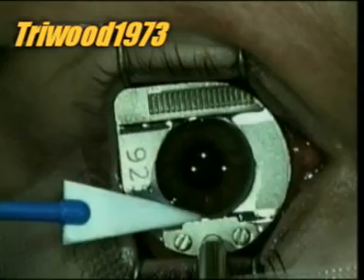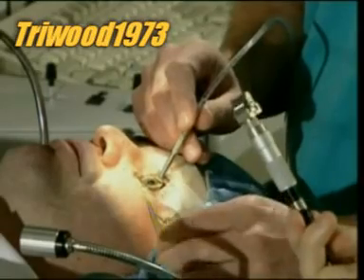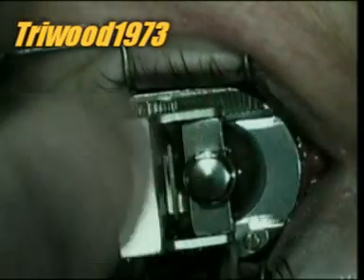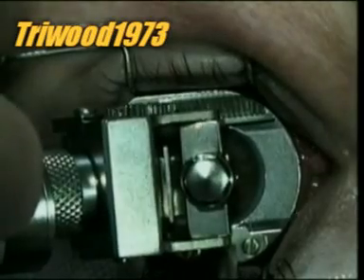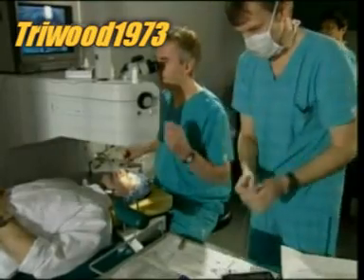The surgeon lubricates the eye with sterile water, then mops up the excess water with a small absorbent sponge. Then the microkeratome is slipped into the grooves in the metal suction ring. In a matter of seconds the device moves across the eye, cutting open a flap of tissue, the same way a carpenter's plane shaves a layer of wood.